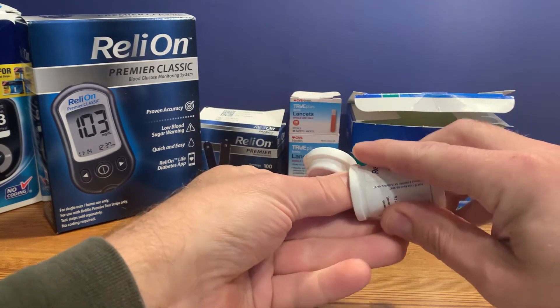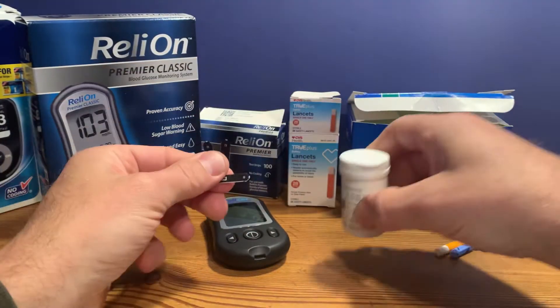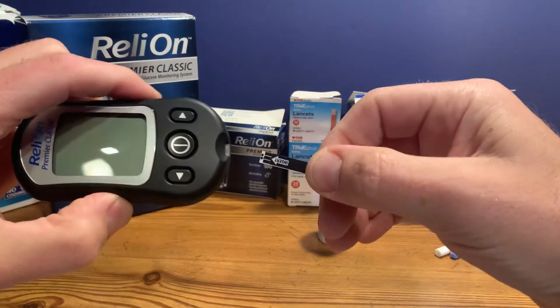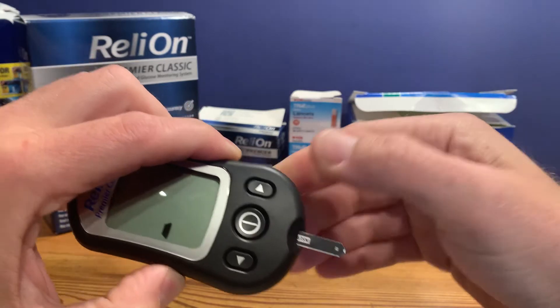The process will vary slightly with each machine, but it's typically very similar. You take one test strip — be sure to reseal the container. This one shows you which way to insert it, so you put that in.